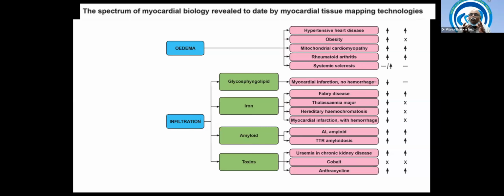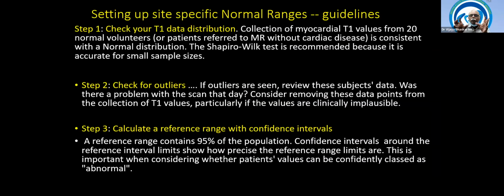So just by giving one T1 map value, I cannot say it is fibrosis, go and take treatment. I cannot say that, because there are so many things. Aortic stenosis, mitral valve disease, cardiac amyloid, obesity, hypertensive heart disease, all of them can produce a significant increase in T1 map values. So you have to remember that it is not just fibrosis. There are so many other conditions it can produce, and it is non-specific, and we need to discuss and evaluate these things later on.